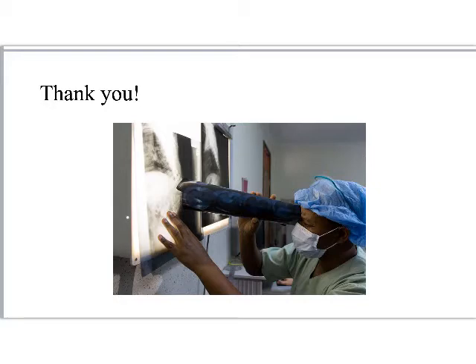Because all we've talked about so far is what's happening at the image receptor. What's happening with that latent image? But does it stay latent? Latent means that it's hidden. No, it is digitally processed now and it results in a digital image, right? So that digital process is the part that we've only begun to talk about. We've defined some terms around it.